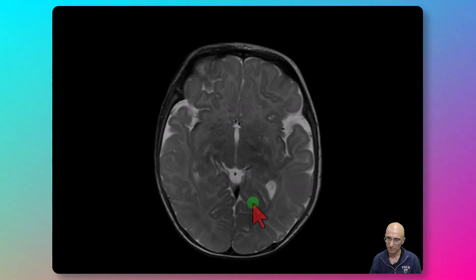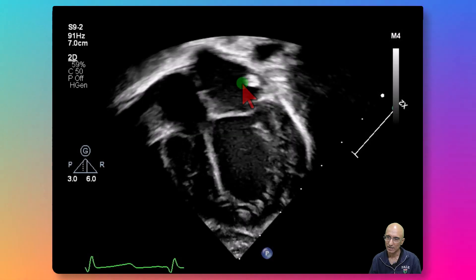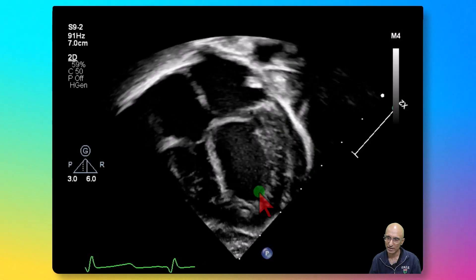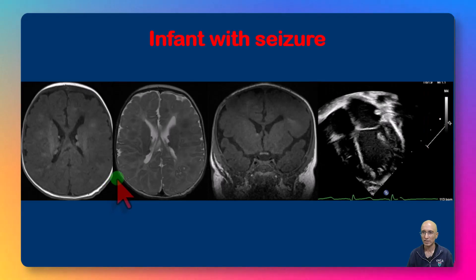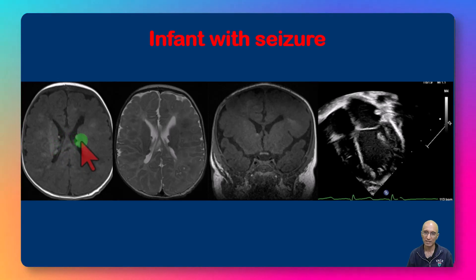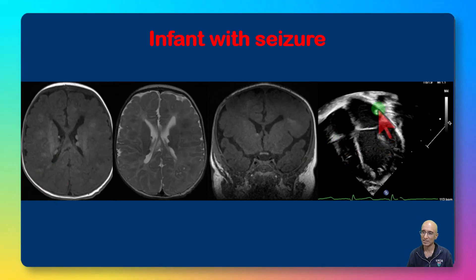As part of the workup, the patient also underwent an echocardiogram examination. On the echocardiogram, we can see a hyperechoic lesion along the lateral wall of the left atrium, and an additional hyperechoic lesion in the left ventricle apical region. So we are dealing with an infant who has multiple sub-ependymal T1 hyperintense and T2 hypointense lesions, additional lesions in the white matter, radial bands extending from the sub-ependymal region to the sub-cortical regions, and hyperechoic lesions in the left atrium and left ventricle.